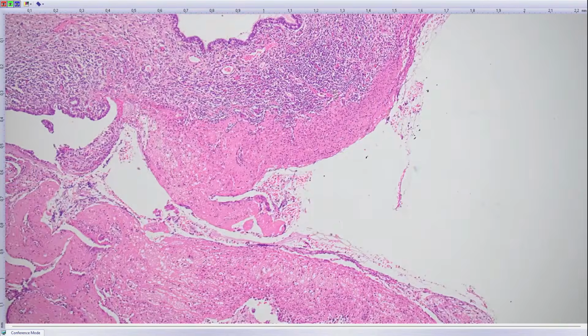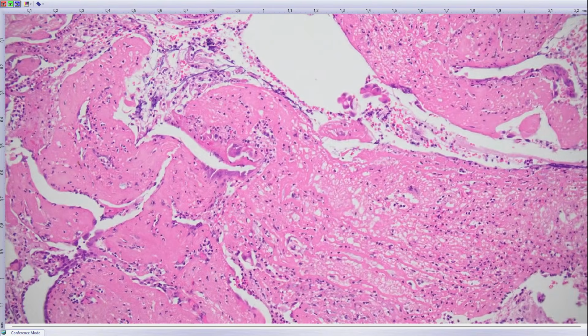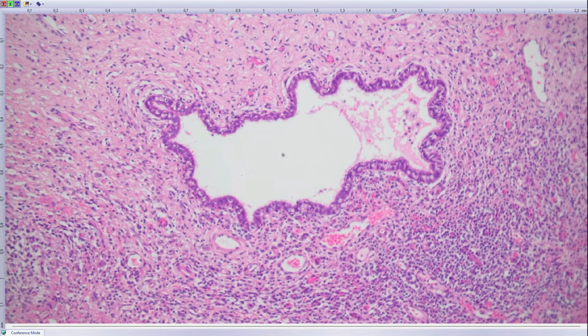Yeah. And you see these eosinophilic deposits. Another place where you can find this eosinophilic deposit in these patients, besides the conjunctiva, is the external ear. You should look at the external ear of the patient as well. They amass something plasminogen-containing, an eosinophilic mass, in these lesions as well, in these areas as well.